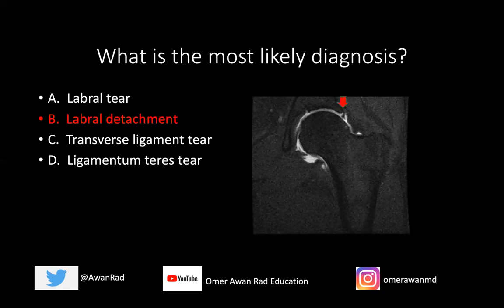The answer is this is a case of labral detachment. This dark triangular structure here is the labrum — this is the superior aspect of the labrum. The labrum is a fibrocartilaginous structure, so it's going to be dark on all MRI sequences. If there were a labral tear, we'd expect contrast to go into the substance of the labrum. We don't see that here.